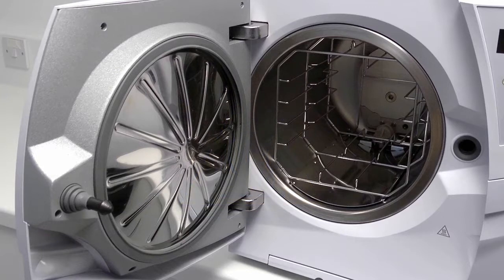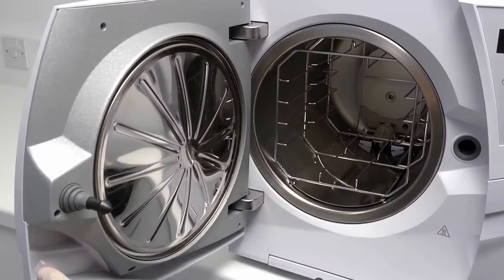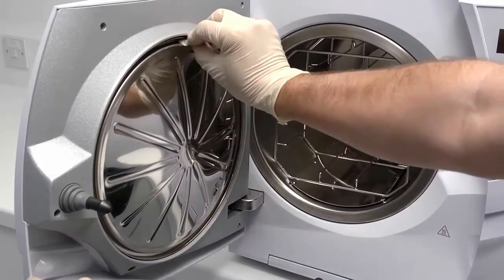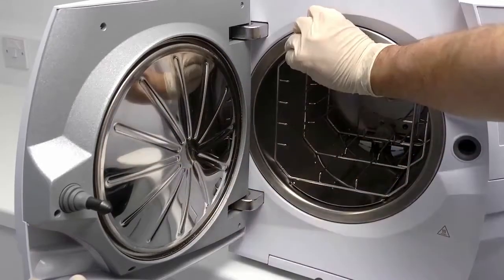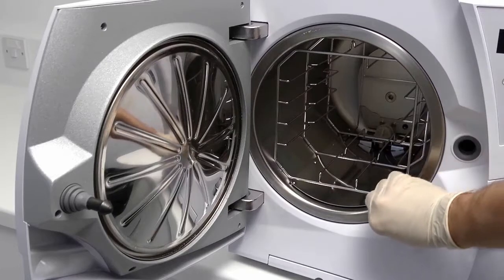To change the door seal, take hold of the door seal and pull directly away from the door to remove the seal completely. The door seal seat and the chamber face should be cleaned before fitting a new door seal. A damp, lint-free cloth should be used to remove any dirt.